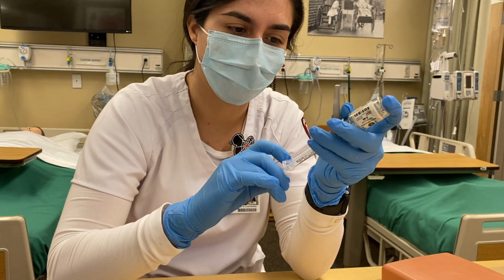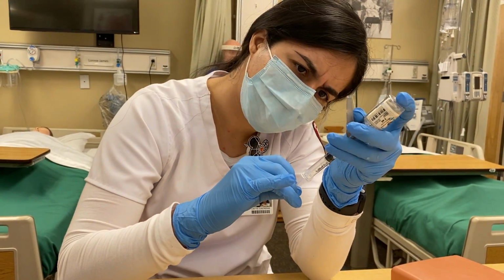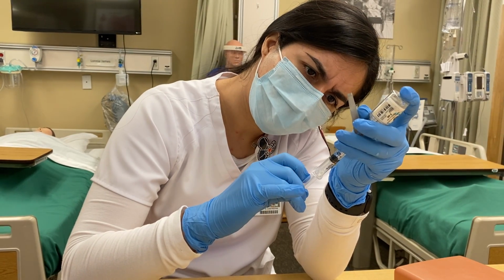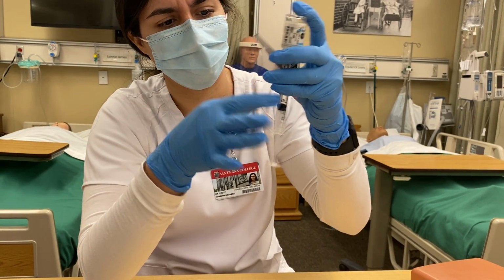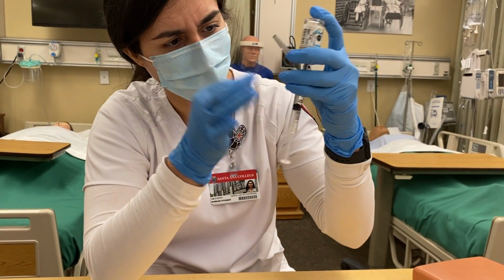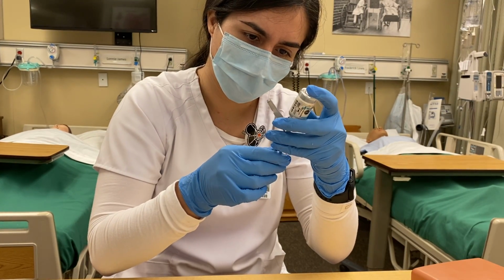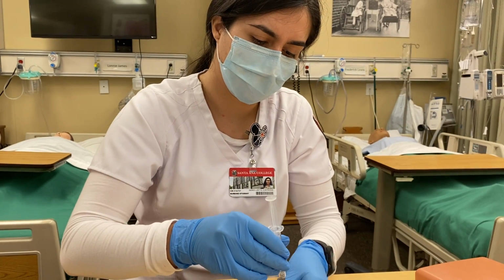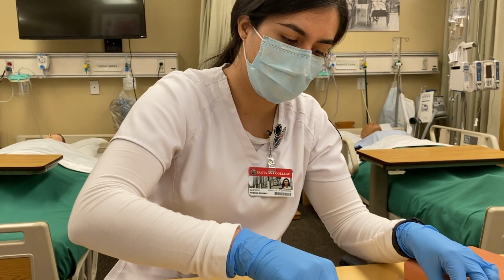Well, the vial's already been used a lot, so it's going to be dripping a lot. Okay. And then there's air bubbles, so I kind of whack it, and I have one tiny one right here. Okay. All right. Put it down. Okay. Take it out, and then go like this. Scoop.